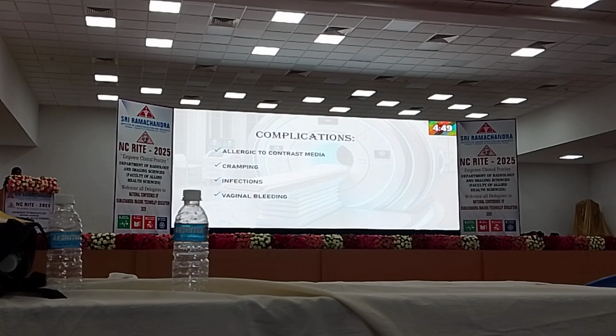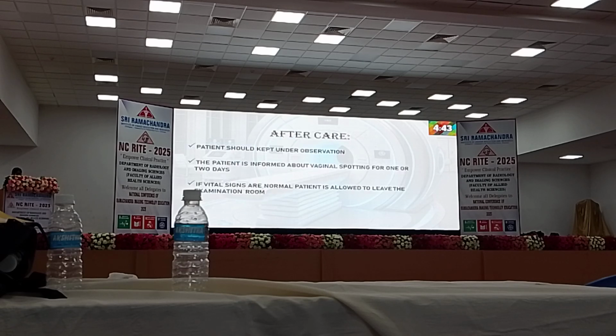Complications. Allergic reactions to the contrast used in this procedure may occur. Mild cramps, infections, and vaginal bleeding may also occur.